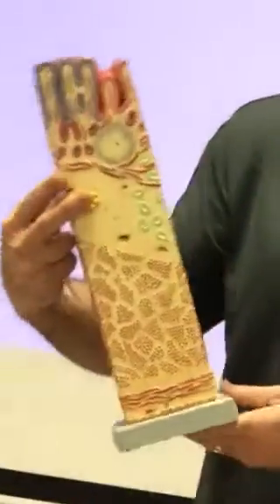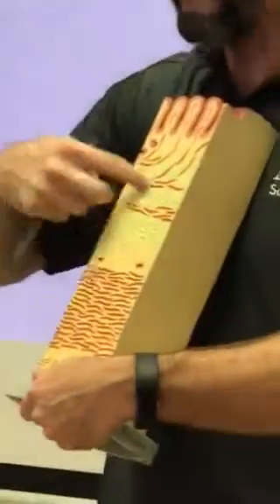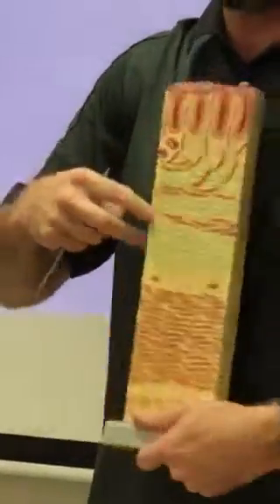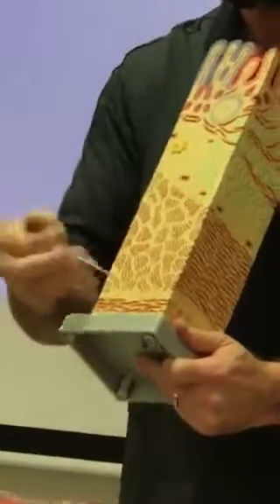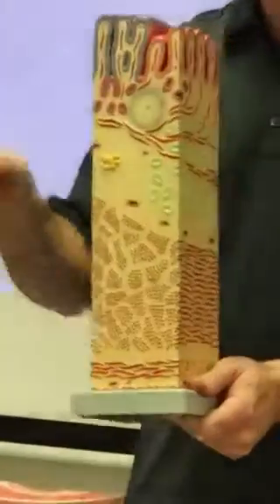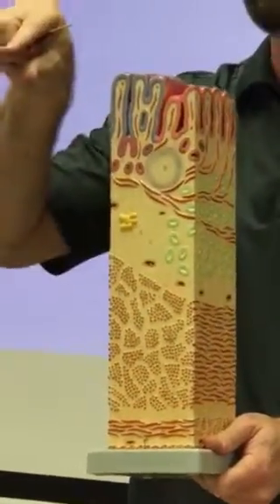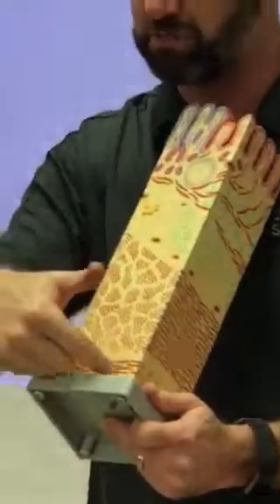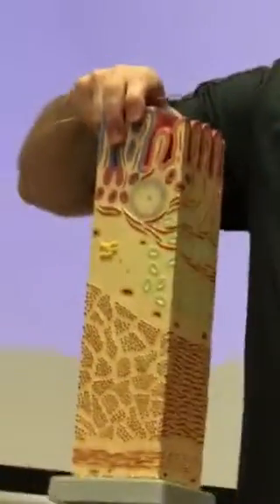And the other thing we can look for to figure that out, if this was large intestine, then this would have to be ileum. Ileum doesn't have submucosal glands. Duodenum does. So it must be stomach to duodenum. And that's what it is. Serosa at the bottom. Right. So the serosa, at some point after leaving the stomach and moving on to the duodenum, is going to disappear. We're at the junction. It hasn't disappeared yet. So don't let the presence of serosa convince you that this can't be duodenum. We just haven't gotten far enough along. It will disappear.